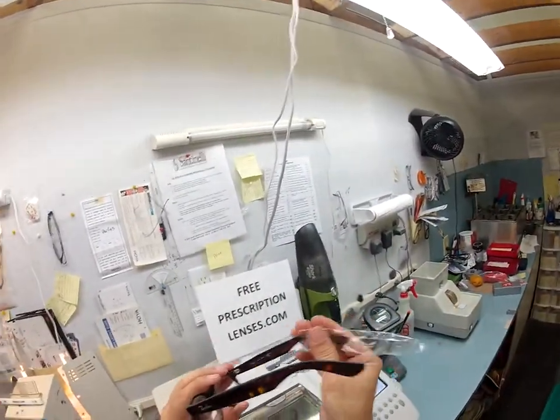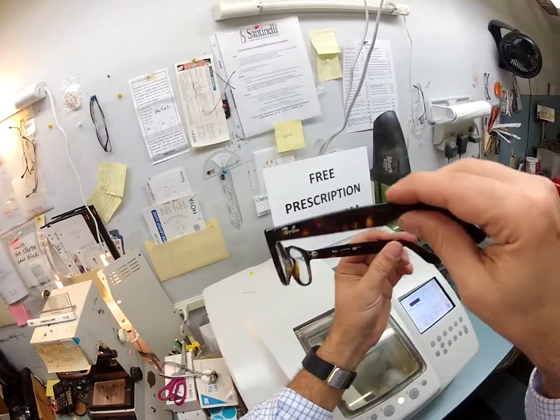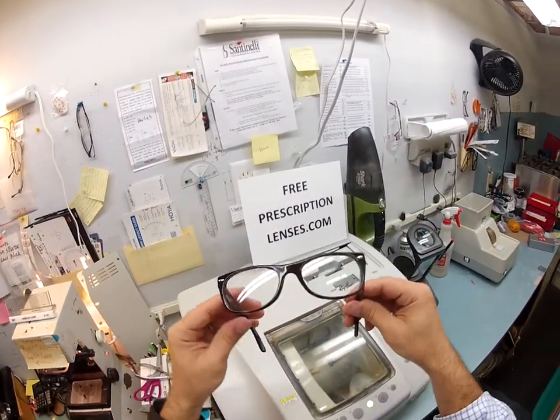If they think it's a good idea to send it with one, well, by golly, I'm going to put a second one on this side when I ship to you, so I have twice the protection. This is the dark Havana and I'm going to cut some clear lenses for it.